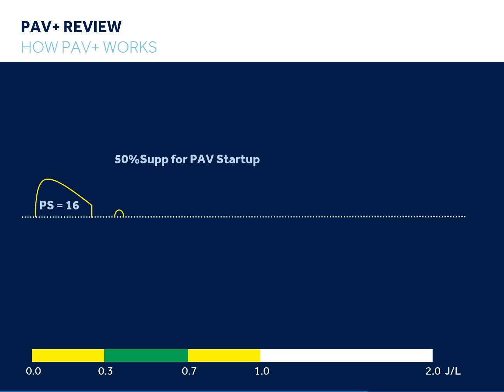As we transition to PAV, you can see that over the initial several breaths, the patient may have to modify their effort to get the tidal volume their respiratory center desires. In some cases, they may not need to change their effort much, or in other cases, there may be significant increases or decreases in effort required to get the tidal volume the patient wants. In this example, you can see the initial breaths in PAV were quite small and steadily became larger.